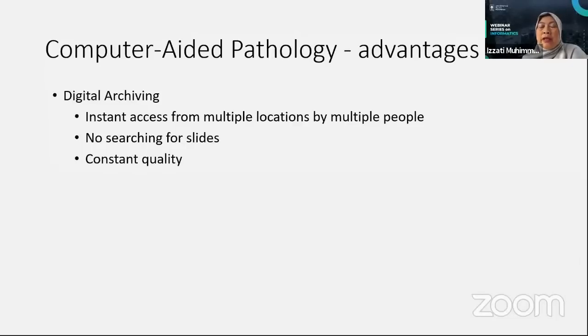And saving the slide has specific requirements in terms of room temperature and the way to handle the slide. Okay, when it needs to be discussed among the pathologists, if there are some difficult cases, for example, the slide needs to be transported to the pathologist.